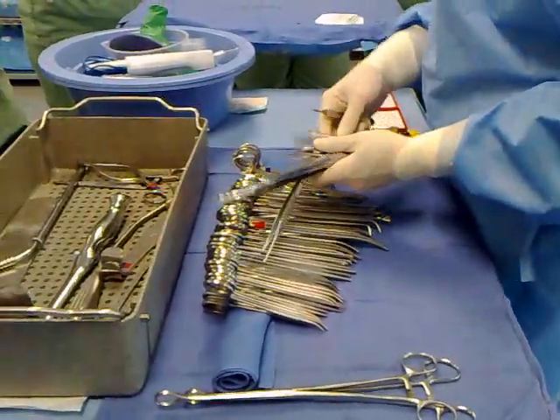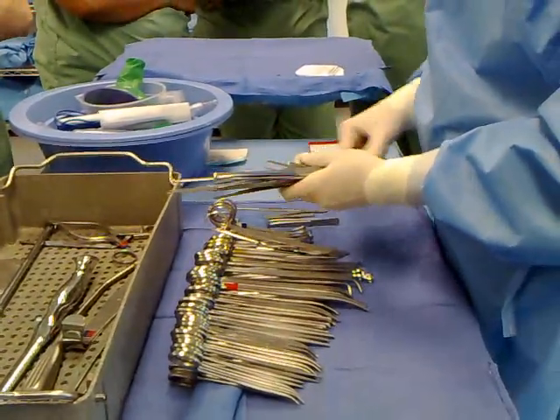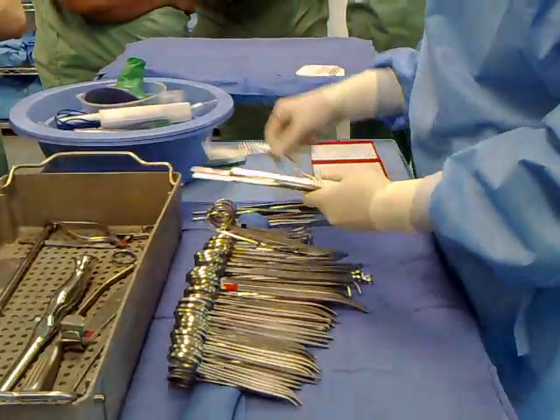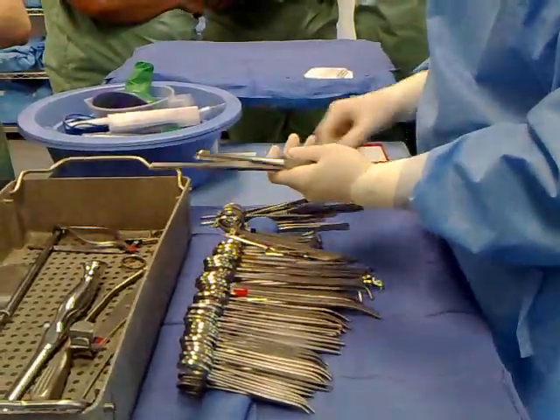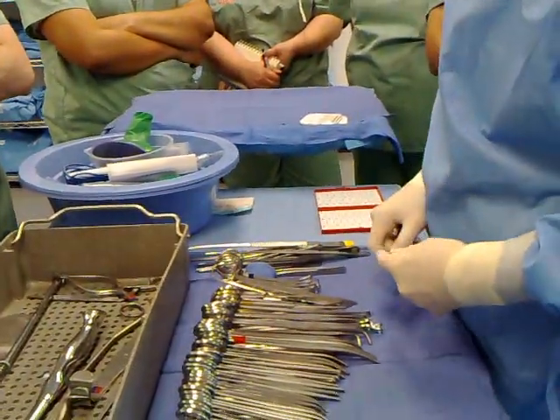Forceps — you can count forceps as a whole. One, two, three, four, five, six, seven, eight, nine, ten. Okay, ten forceps total.